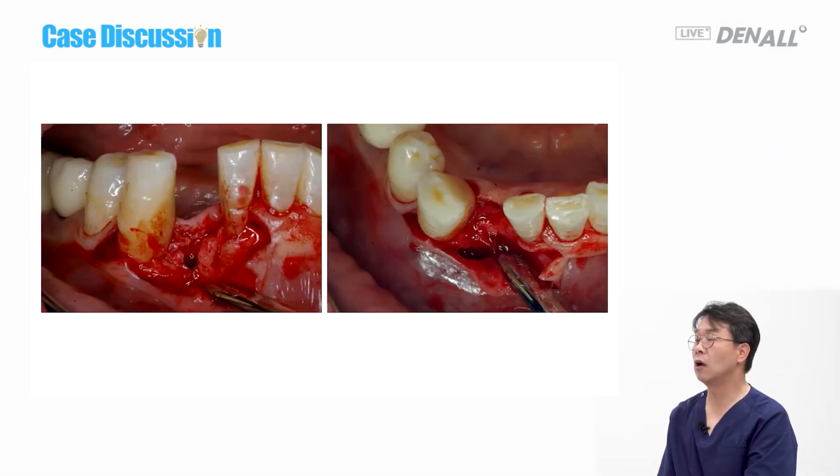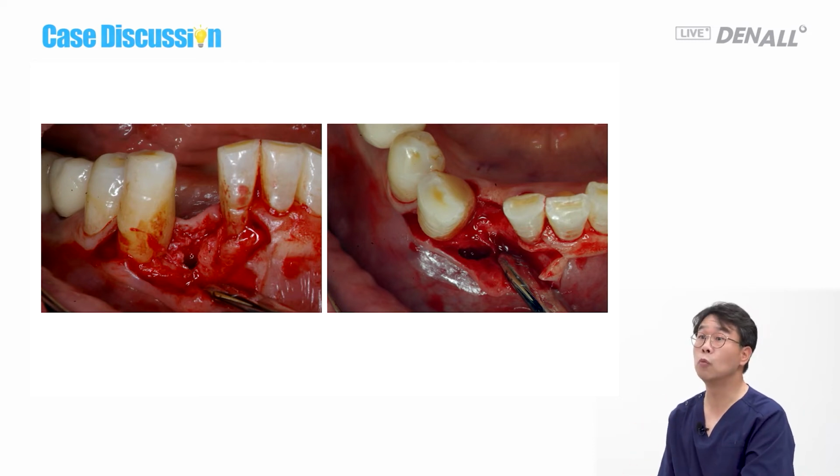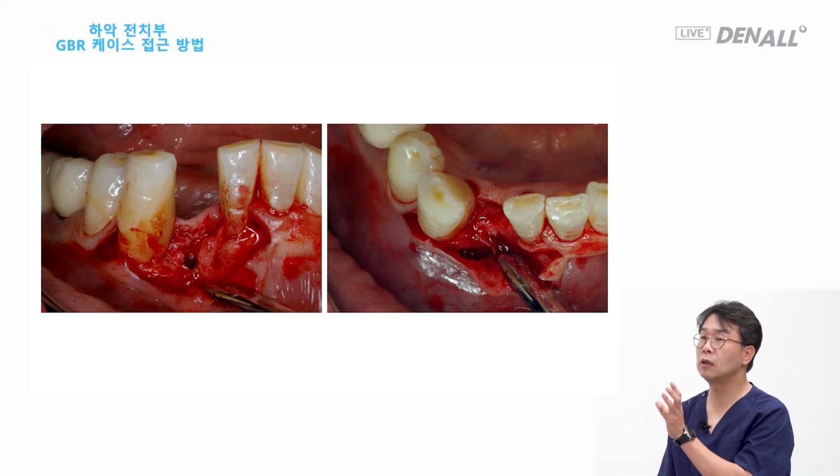Without a surgical stent, you need to rely on your clinical experience, and you'll have more regrettable outcomes than satisfying outcomes. As was discussed in other cases, one guide and tool can be used, and a surgical stent can be used as well. Accurate positioning is the most important thing.